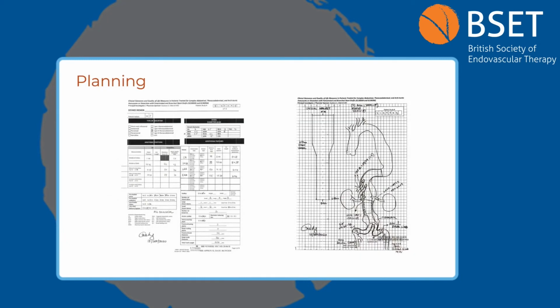Second, I want to point out some of my measurements here. The inner aortic diameter was about 36, which is fairly large, at the renal arteries. Remember this number. And the renal arteries were tough ones. They were very posterior, tortuous, with a posterior orientation and a little bit upgoing. So I was concerned about the use of branches for the renal arteries.